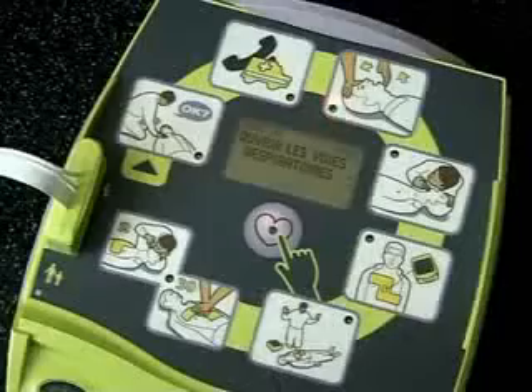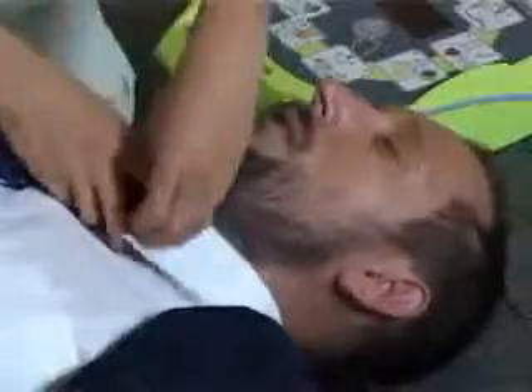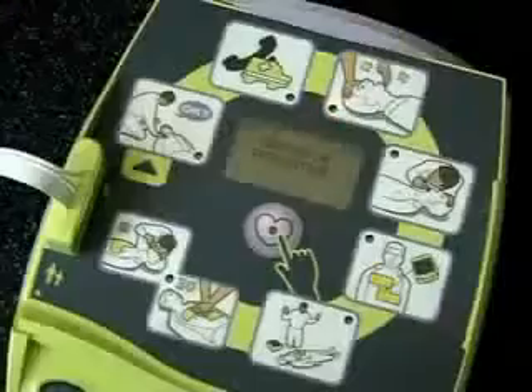Ouvrir les voies respiratoires. Vérifiez la respiration.